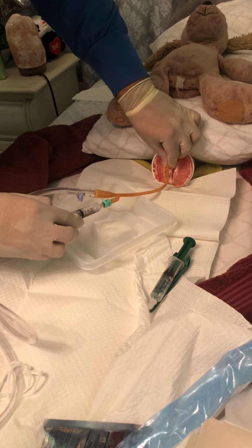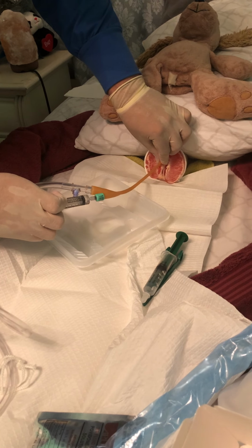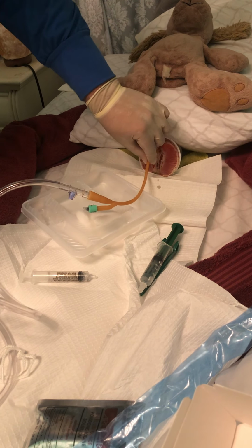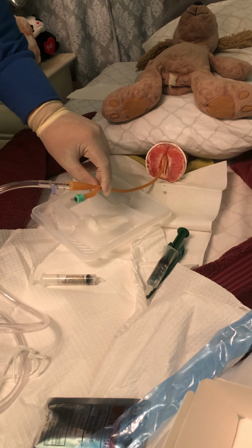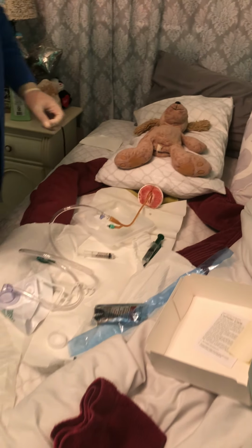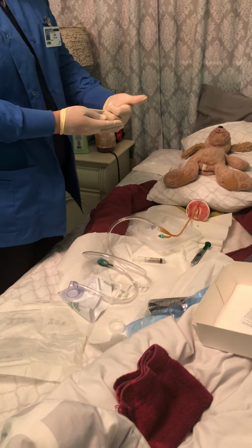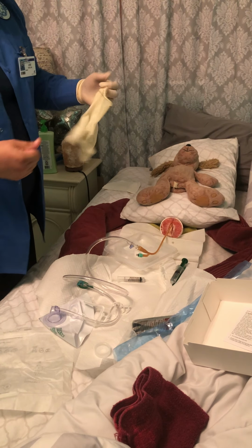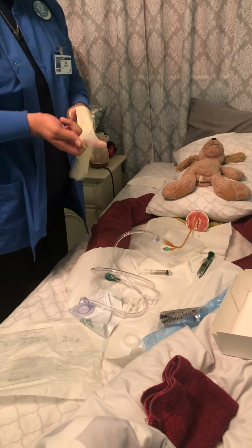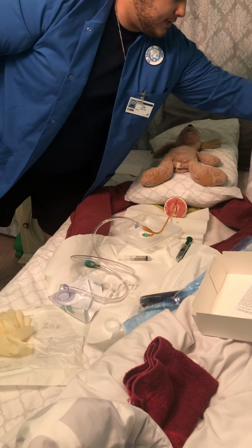You know, not too fast. And then you can just pull back, and that's how you know you're in. It won't come out anymore. Alright. So we're going to take off sterile gloves here. And hygiene. We're gonna put these gloves back on.